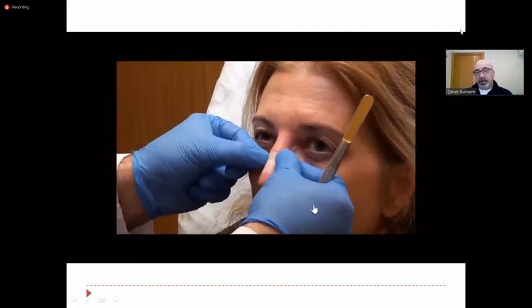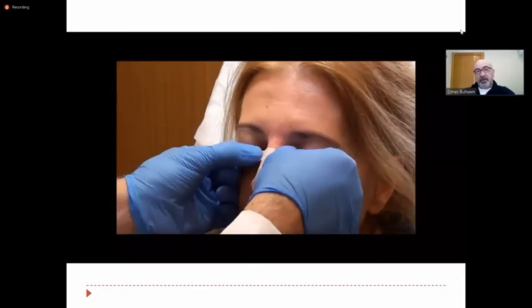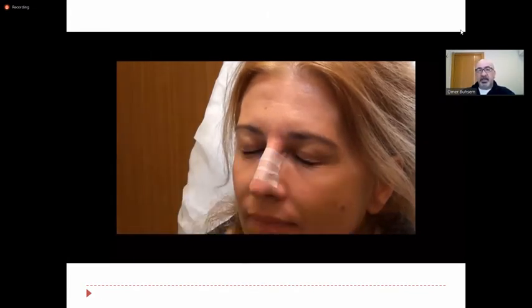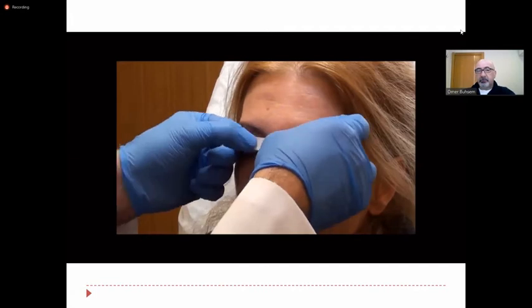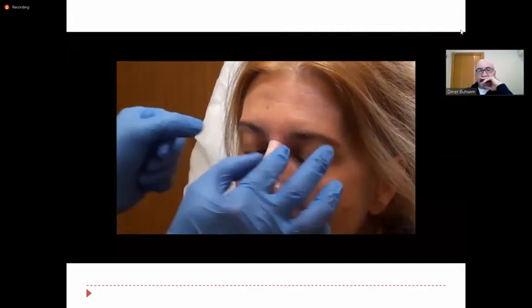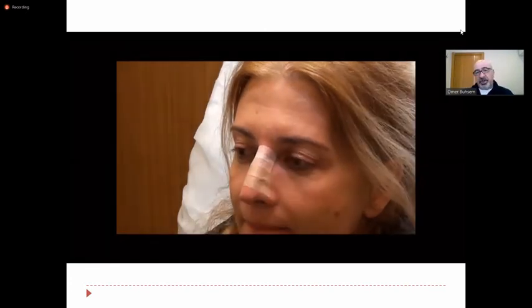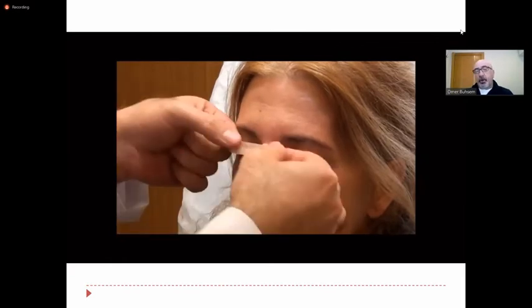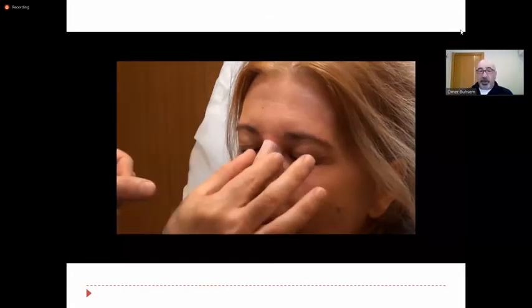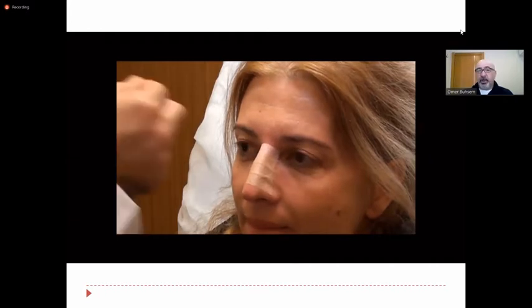Okay, we will tape now, and the day after you can remove it. Just the same day with injection, and the day after you can remove all the tapes, no problem. You have to be sterile, in very asepsis conditions. It's very important, because we do massage, we do molding, so we use our fingers too much. So to prevent contamination, you need to work in really asepsis conditions.